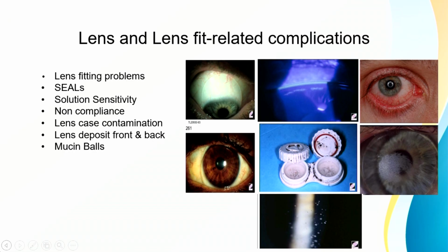So cleaning will be re-emphasized, and maybe we can shift them to RGP lenses if deposits are more. And if the lens storage is not proper, better to counsel them on daily disposable lenses.